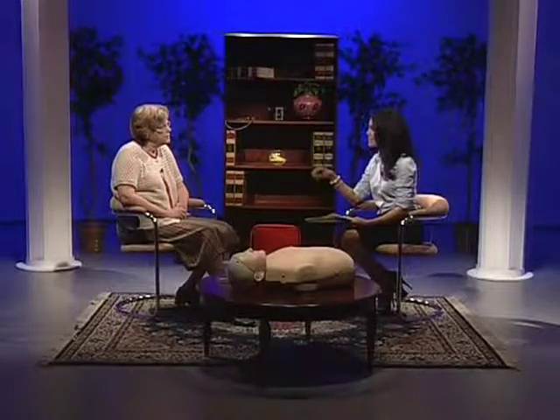Okay. We had talked before, we mentioned the sticker, the sign that we saw on the way in here that there was an AED device available in this building. I've heard that it's important to notify local EMS that those devices are on site. Can you tell us why that's important? Well, actually, again, in the state of Kentucky, to set up an AED program, that's one of the things you're supposed to do, is contact your local EMS and let them know that you're purchasing and going to have an AED on site.